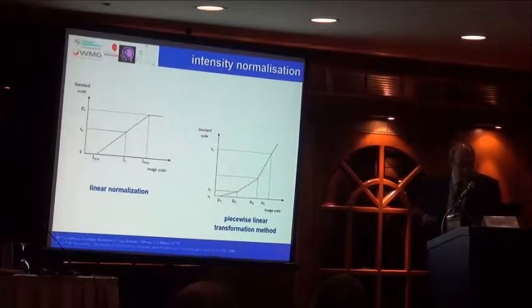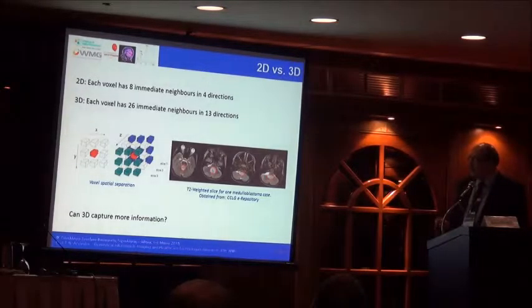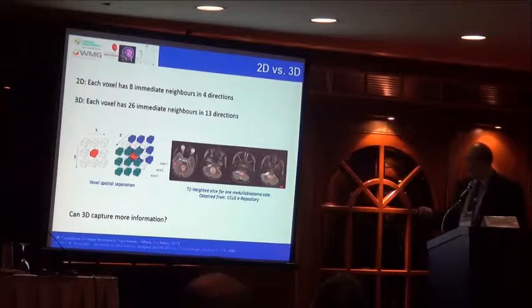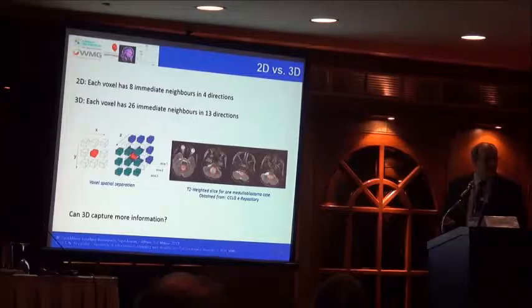And this allows us to put the images in the same intensity so that we can do first, second, and third order statistics when we have a model-based approach. Of course, the choice then is, do I do it on a slice, or do I do it on multiple slices? Or if I have a 3D volume, and somehow I can segment the 3D volume, can I do it like that? Of course, 3D volume segmentation is still very much in its embryonic phase for clinical work.